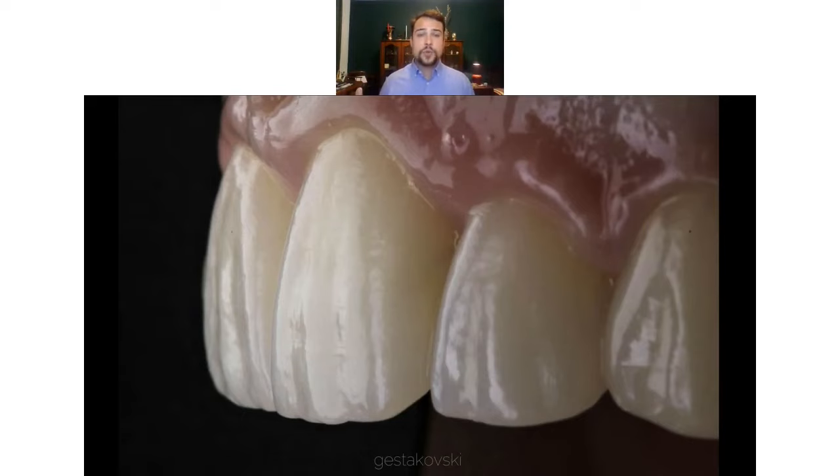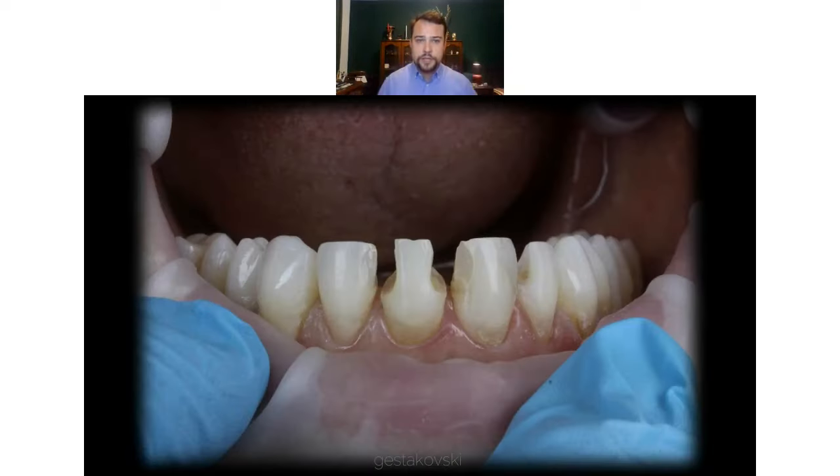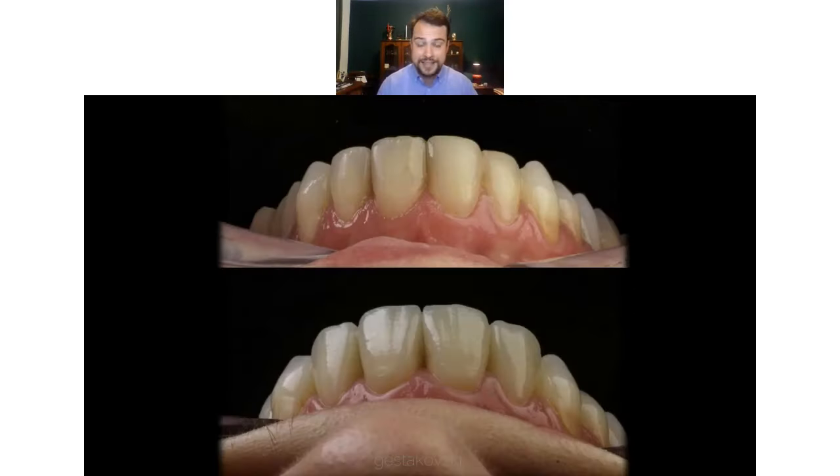Okay. Can we do it with interproximal cavities, interproximal caries, or old fillings? Yes, of course. But first, we need somehow to block the black from the background and later on inject on top of it and get this result. The uppers are also composite veneers, the lowers are also composite veneers, but you can see quite a difference because of the design, approach, and polychromatic protocol.